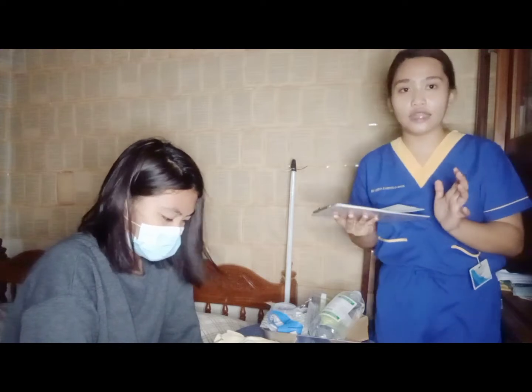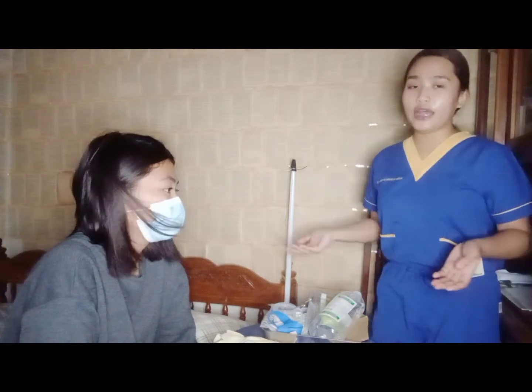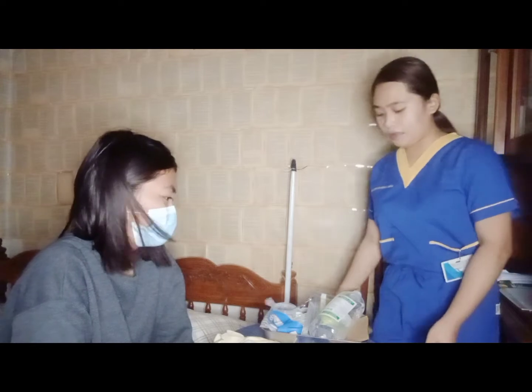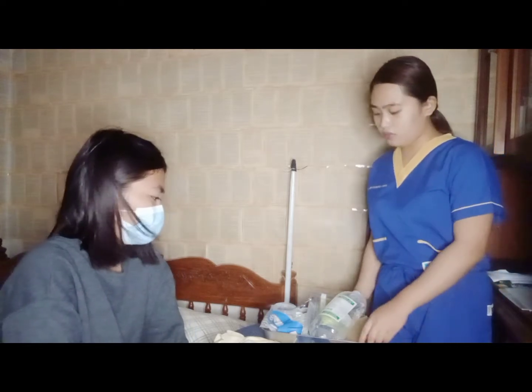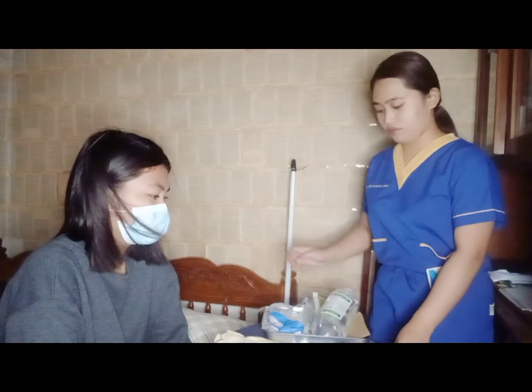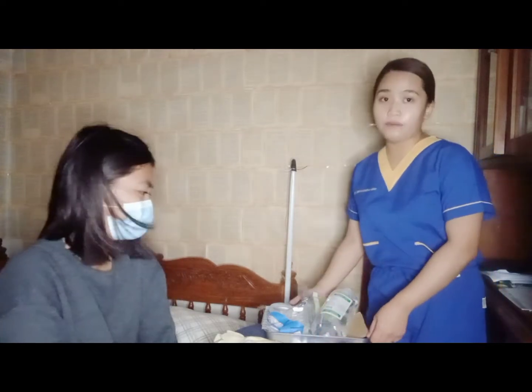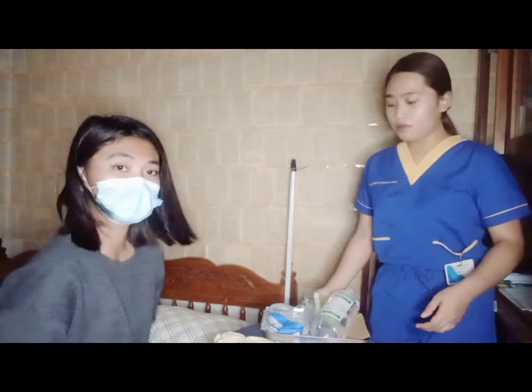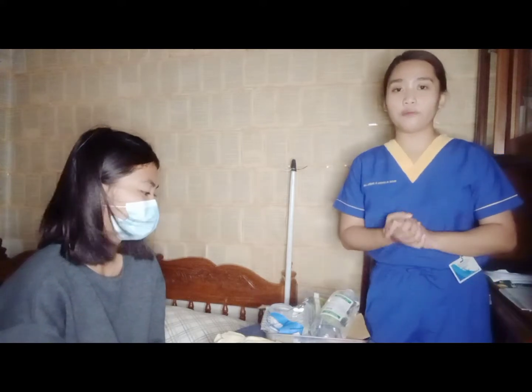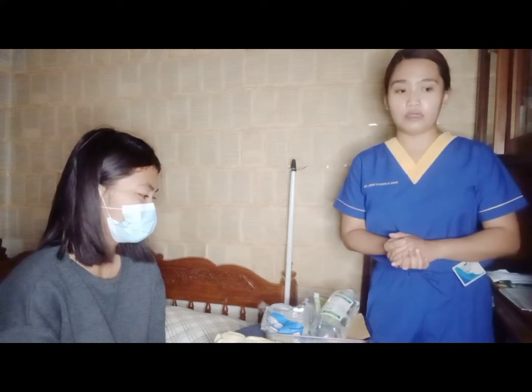After checking the doctor's order, now we will gather the equipment at the bedside table. So, here are the equipment for the procedure. This is to save time and to have ease during the procedure. Next, you'll perform hand hygiene and put on the PPE, or personal protective equipment.